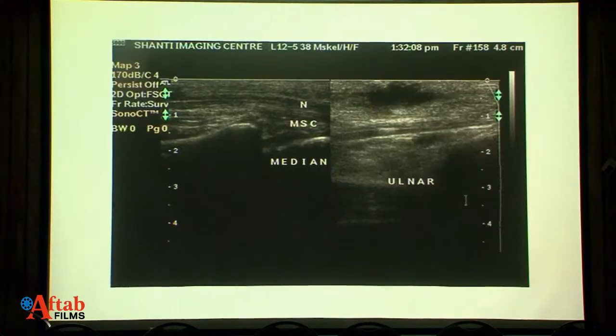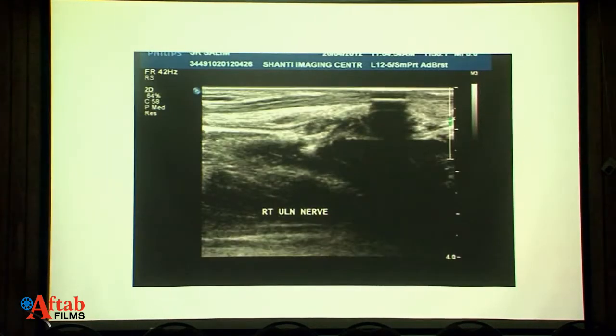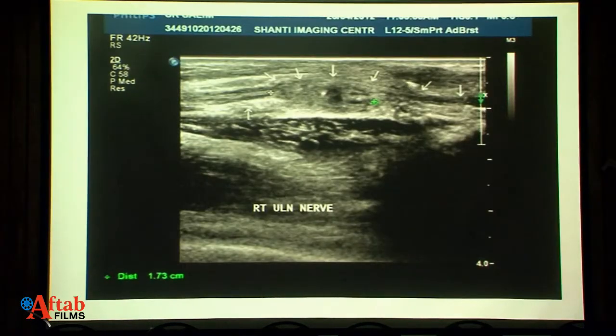This is again a case of compression injury, where there is muscle injury with a hematoma, and it is compressing the nerve. And this is the fag end. This is showing early neuroma formation. This is a neuroma, formed very well, and these are the proximal and distal ends of the nerve fibers. You can actually give the distance so that the surgeon will decide about the local repair or the nerve graft to be done.